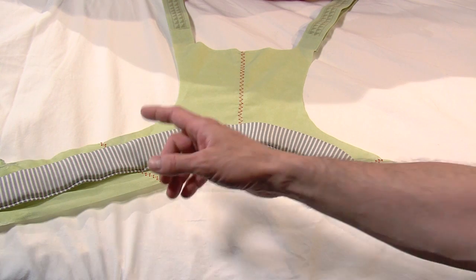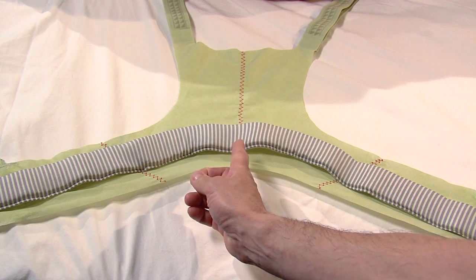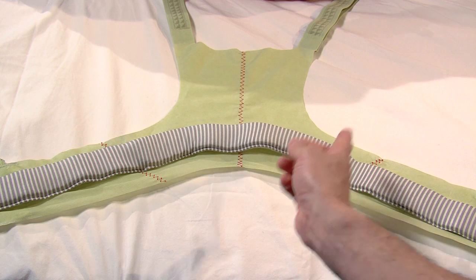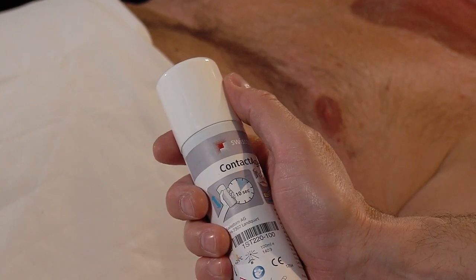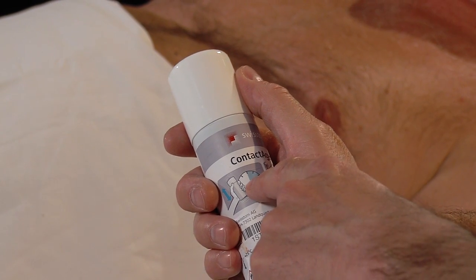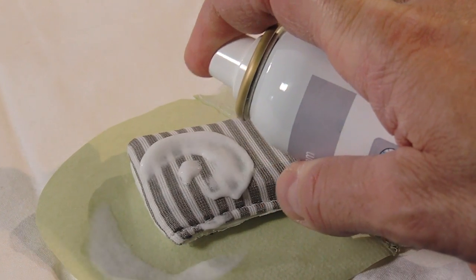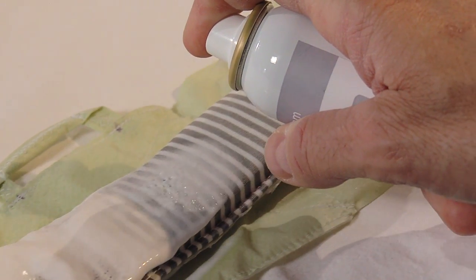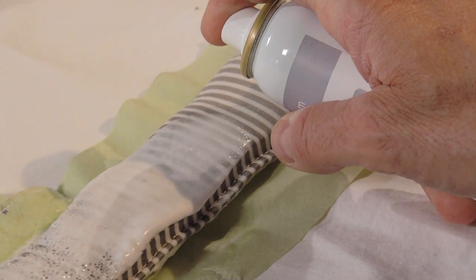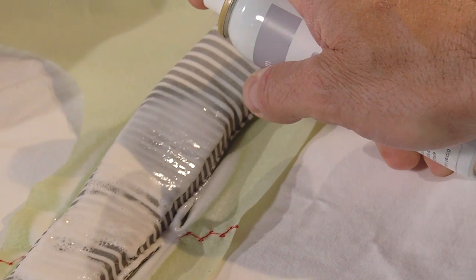You will find three indicator lines on the sensor belt surface: one diagonal line on the left hand side, a mid line, and another diagonal one on the right. Take a can of contact agent — a foam which enhances the electrical contact — and shake it well for a few seconds. Start applying the contact agent at the very end of the stripped textile of the patient interface and do not stop before you have reached the other end. Make sure the foam is applied evenly.